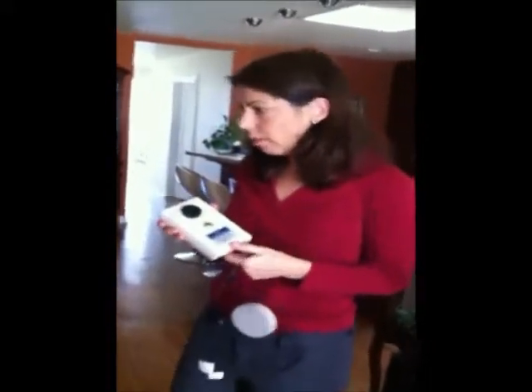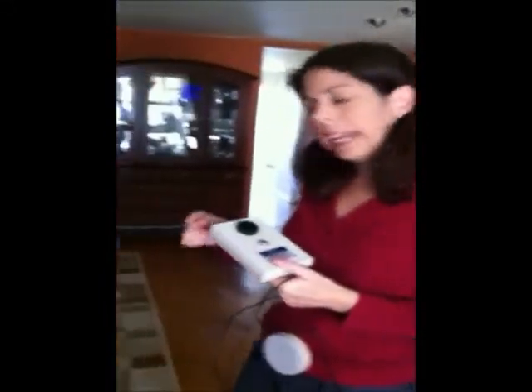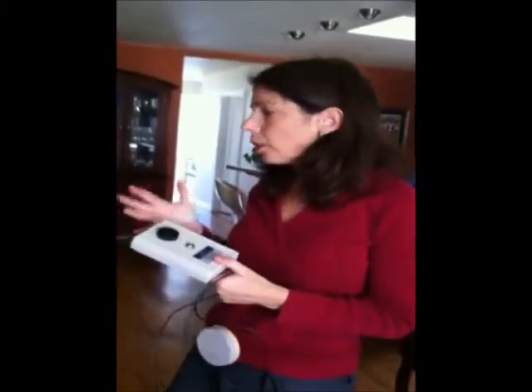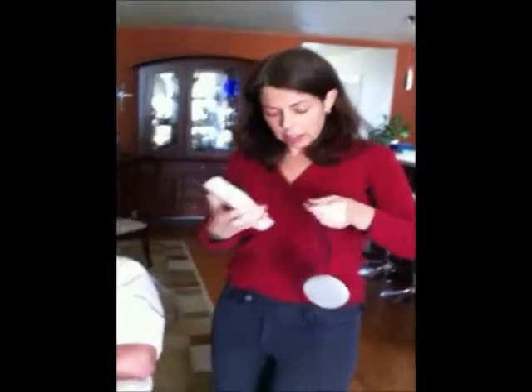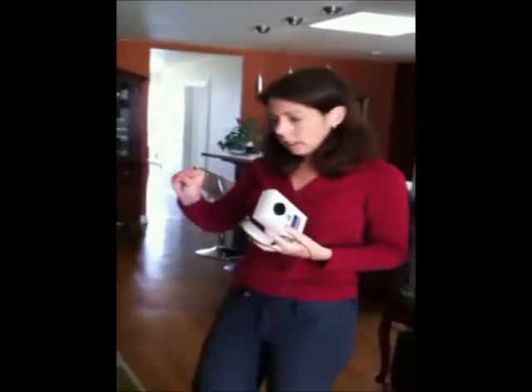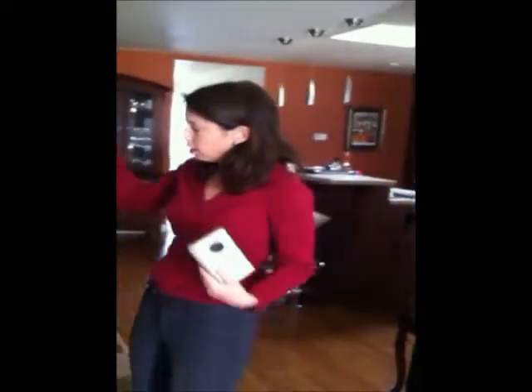Today I'm going to set up an adaptive call chime for someone who can't hit a doorbell or ring a bell. It's very important that there's always some sort of call system for a person. This is Ozzy. He uses his Dynavox for a call chime, but sometimes, like when he's in bed, he doesn't have it on. We're going to set it up today to work with head movement instead of the use of a hand to turn the call chime on.